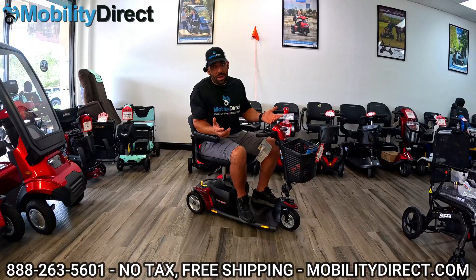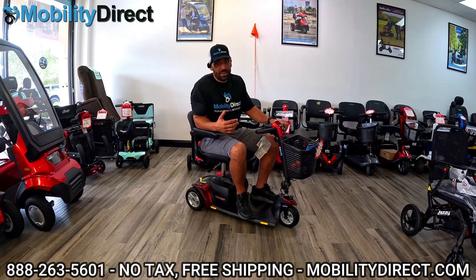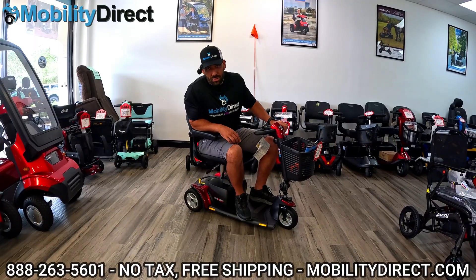If your mobility scooter is not powering on, or if it's just losing power really quickly, then you're going to want to test it out to see if you need new batteries.